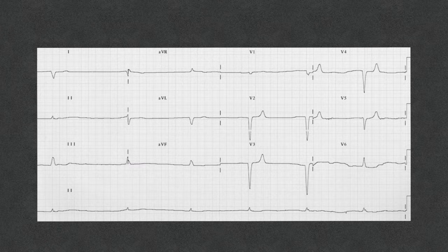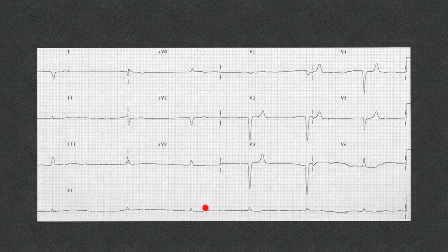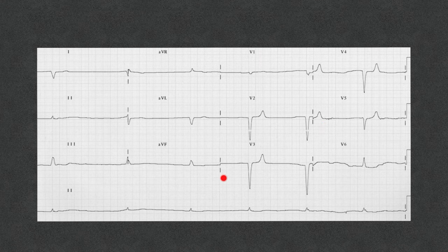This last EKG shows bradycardia with a heart rate probably in the 30s. I don't recognize any P waves, and the QRS is wide — this is probably a junctional escape rhythm or ventricular escape rhythm. You can see the T waves are peaked. Whenever you see this, suspect hyperkalemia and initiate treatment immediately.